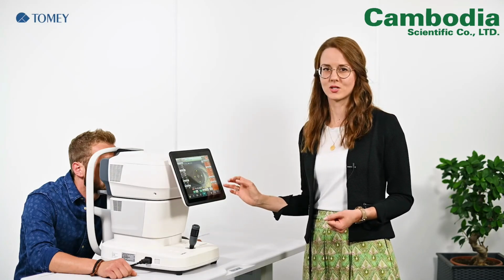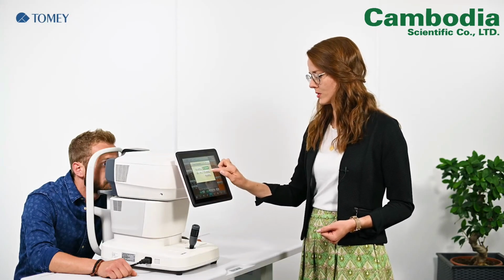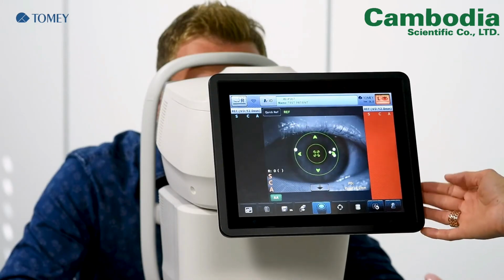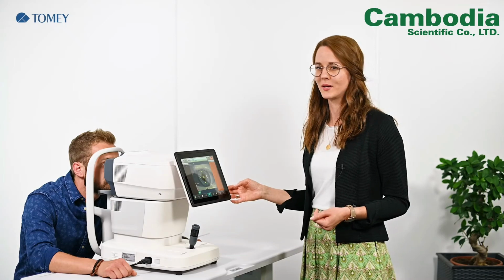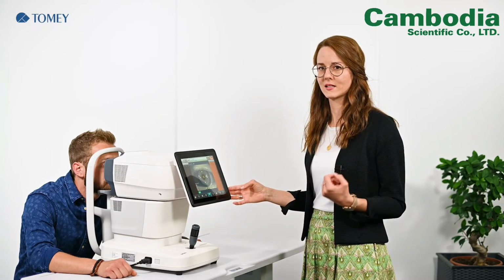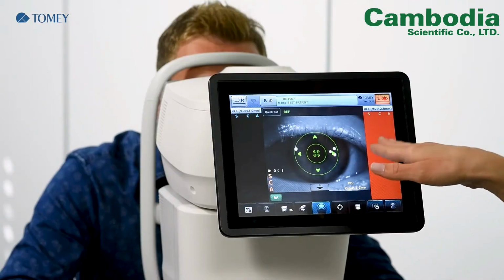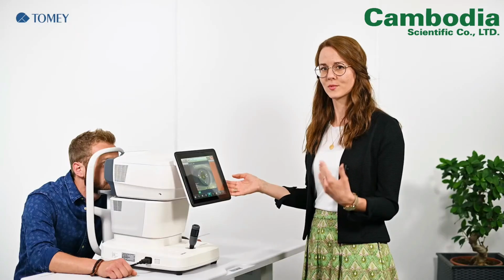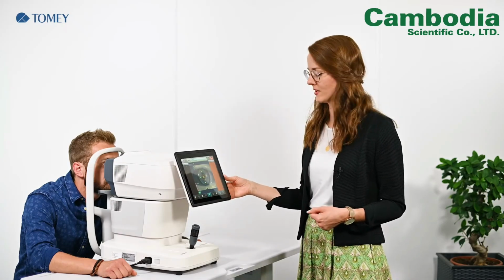I will show you a special measurement as well. This is the quick ref mode. The sense behind the quick ref mode is that it is implemented for nystagmus patients and uncooperative patients, and also for patients with less fixation possibility. So if the eye is struggling a lot and a normal refraction would not come to a result, in this case, you will at least get a starting point.